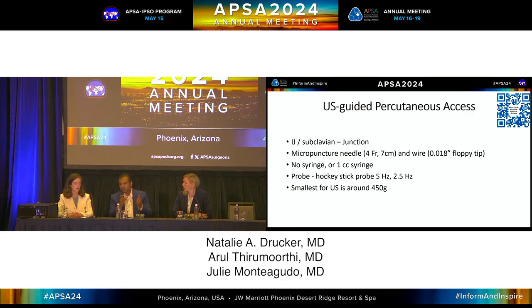And so the micropuncture access needles and some of the others come in a 4 and a 7 centimeter. With the 4, you're going to get in your own way. You can try holding the L-shaped probes the other way around, but in general, you want to have options for being able to rotate your hands. So the 7 centimeter, even though it seems long, and it can seem longer than the child, keeps your hands enough out of the way that you can really get access.